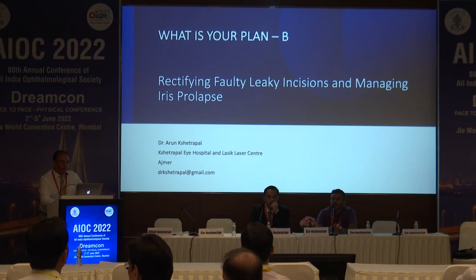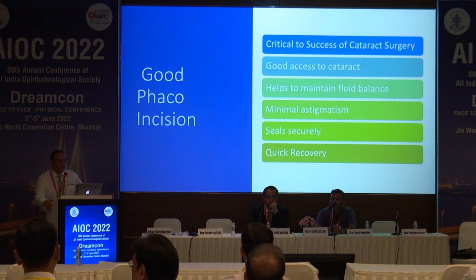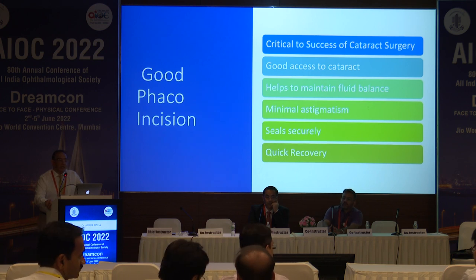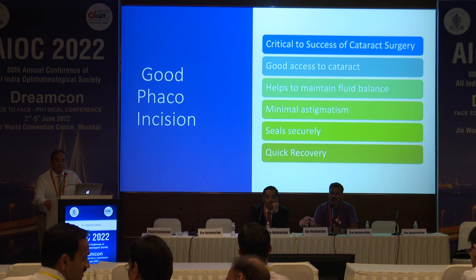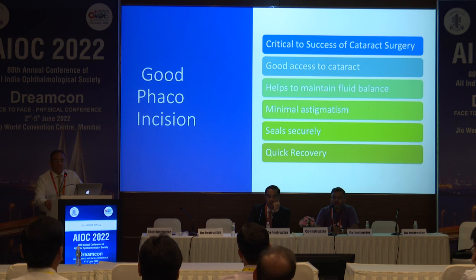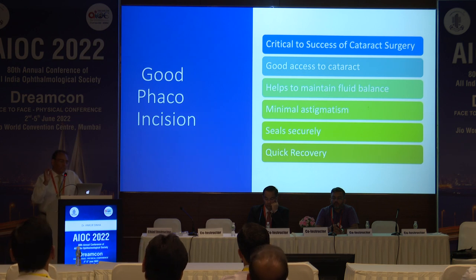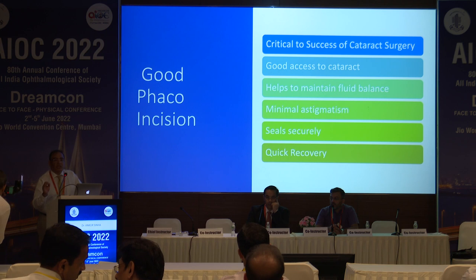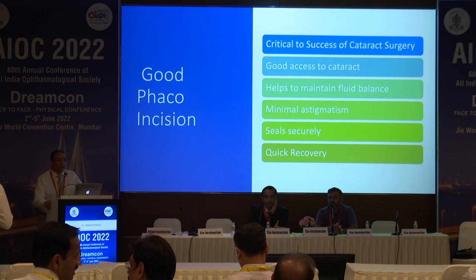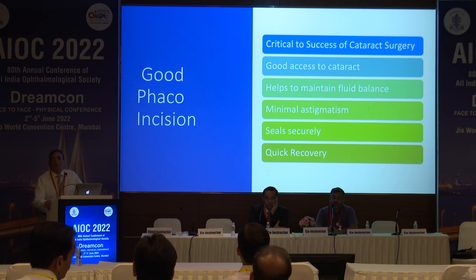Good phaco incision is critical to the success of cataract surgery, and it also gives you good access to the cataract and helps to maintain the fluid balance. A good phaco incision should ideally induce minimal astigmatism, seal securely, and not only that, it gives a quick recovery to the patient. So the incision is the very first step in the phaco surgery, and it should be a perfect incision. And in case you're not able to make a perfect incision, I'll be talking about how to deal with that.